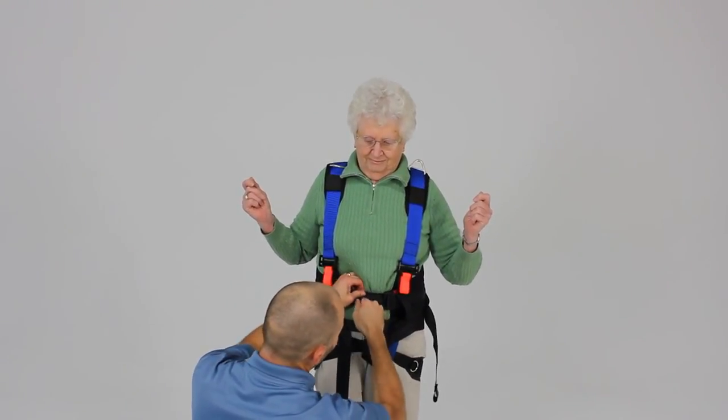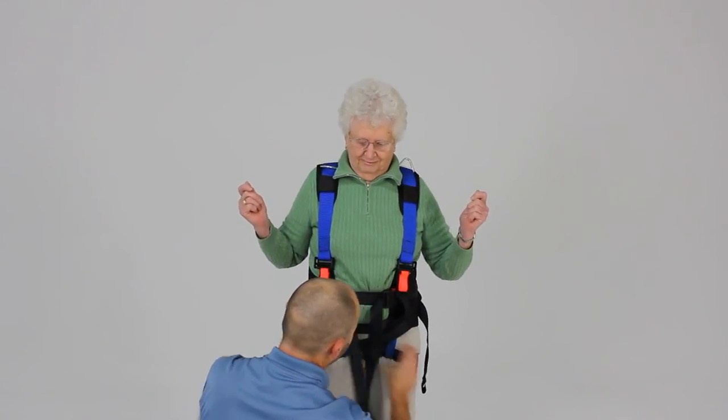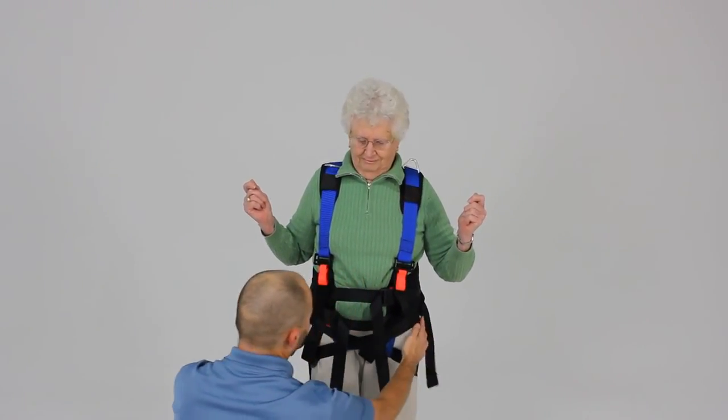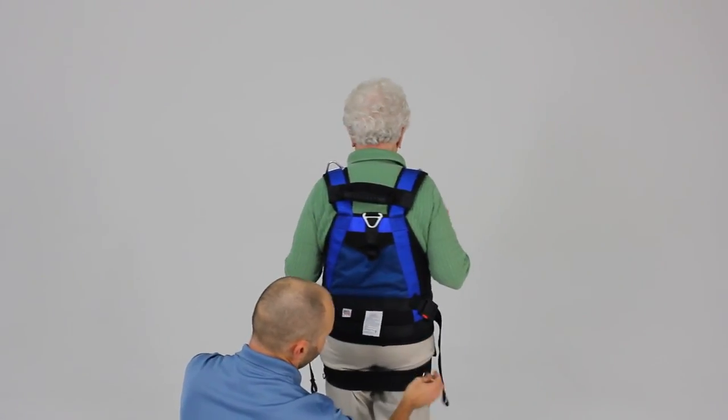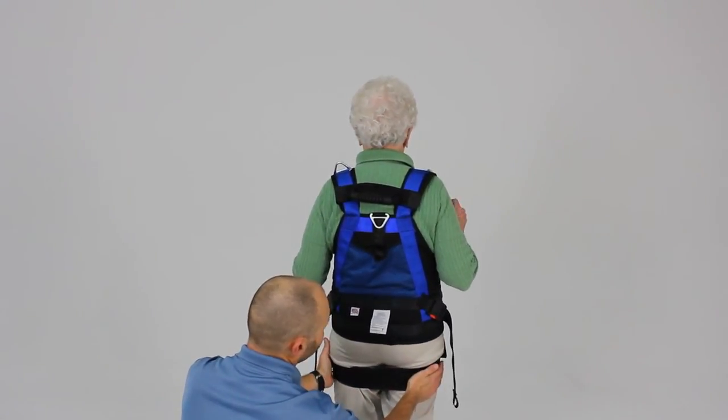At this point we may also want to take up a little more slack at the waist belt. So we'll go ahead and turn around to show the position of the webbing and the pelvic support strap at the gluteal fold.